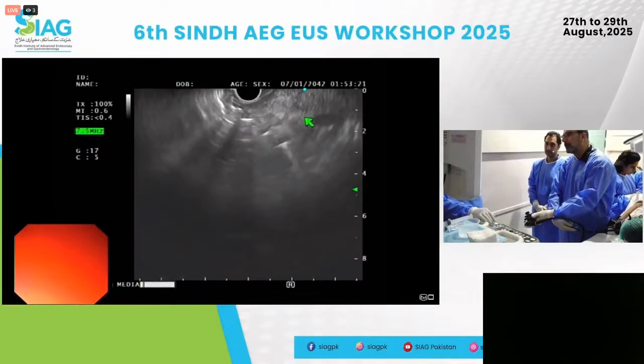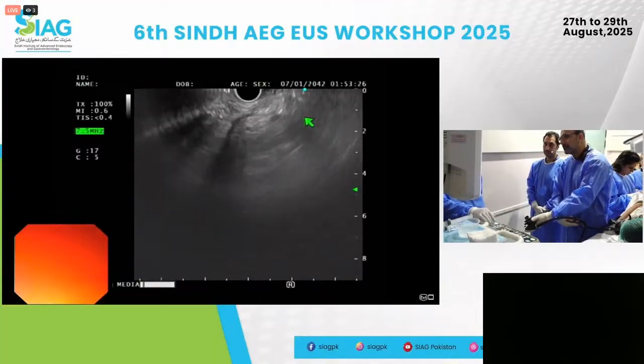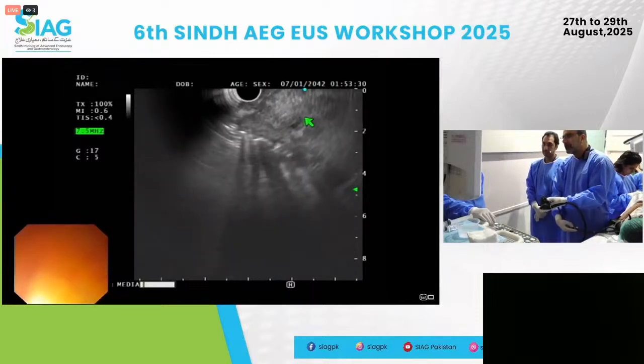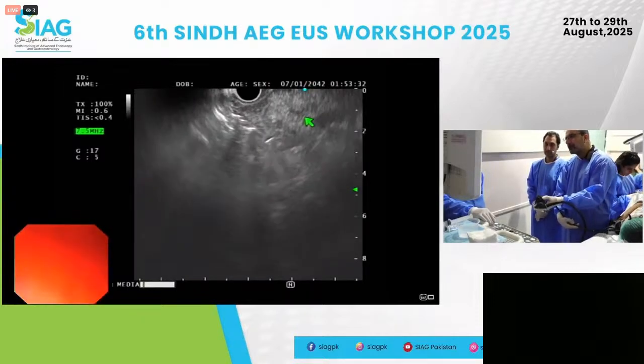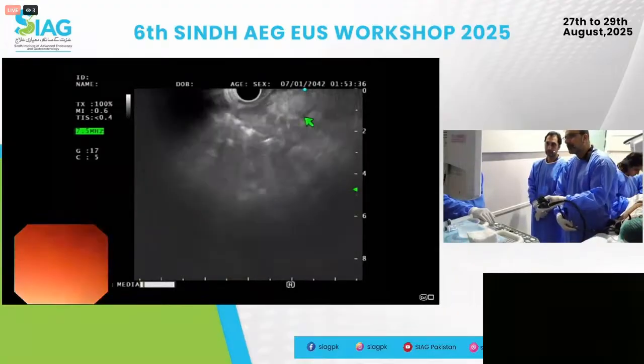And if I keep going clockwise, that's my uncinate, right? And those are my mesenteric vessels. But the main thing in the second portion with these structures is you have to have a small amount of pressure on the big wheel, and then you just do gentle back and forth. So I'm doing back and forth.